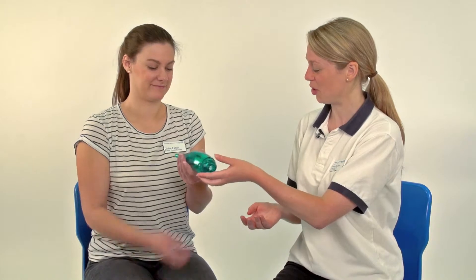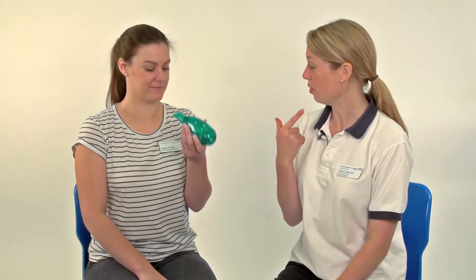Right then, so if you want to have a hold. What I want you to have a go at doing is popping the mouthpiece into your mouth, creating a good seal so that there's no air that can leak out. Breathe in through the Acapella and then take a nice prolonged breath out — keep blowing — and relax.